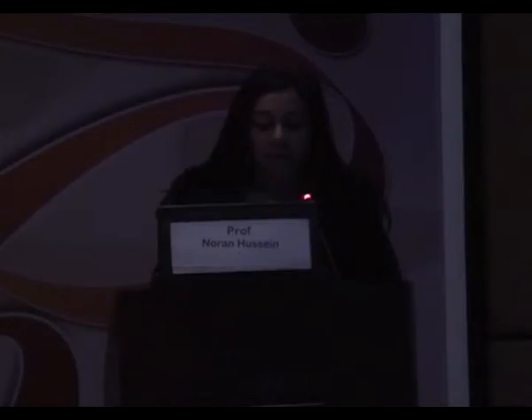This is a classic case of bilateral cancer, and here we can see that contrast has been taken up very nicely. We have our palpable mass over here, as well as the axillary lymph nodes, and both have taken up contrast. We have clumped enhancement, and we have another nodule here enhancing, and the other side as well shows linear clumped areas which were DCIS. So this was a bilateral carcinoma which has showed good enhancement, and we can see the contrast within the heart and the vessels and the lymph nodes.